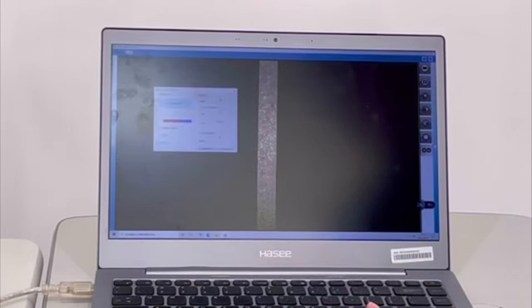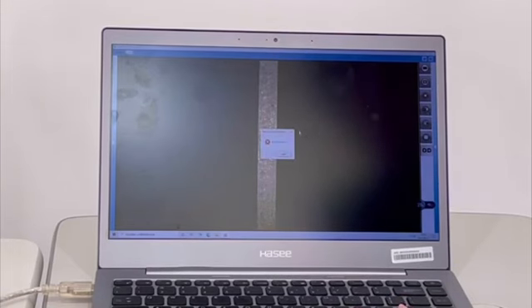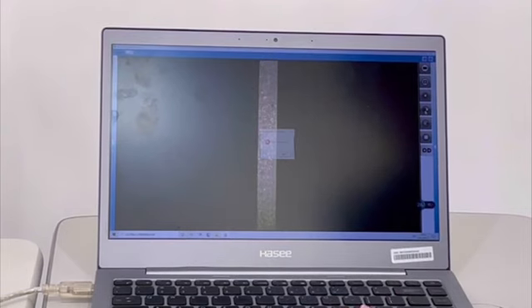You can change the contrast, and there is also a wave flip. Wave flip, you need to uncheck it when the module is used with a Z-type slit lamp. This one is the digital image system, the patient files. There we have the export, and also the comparison. OD means you can change between OD or OS.